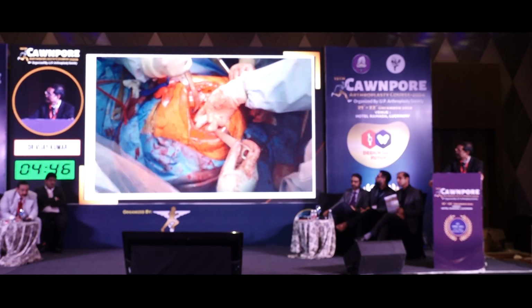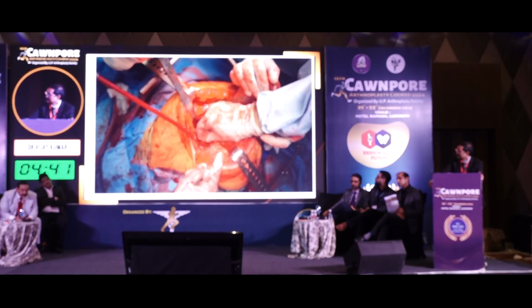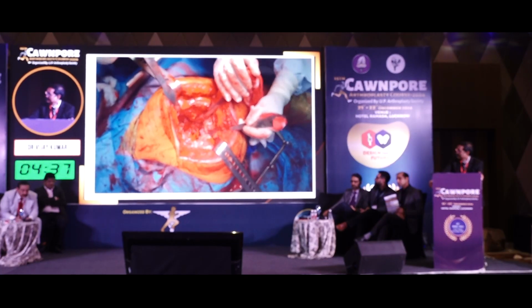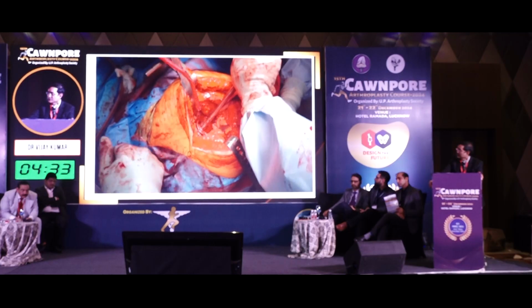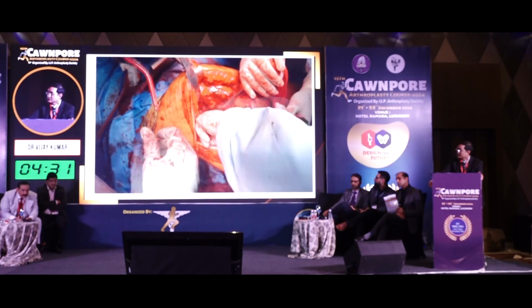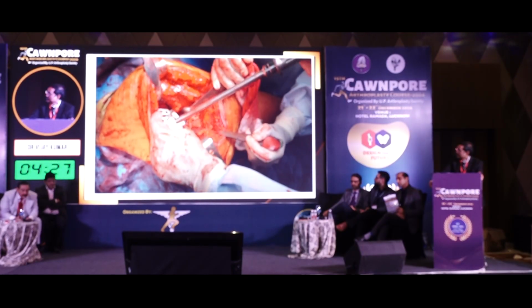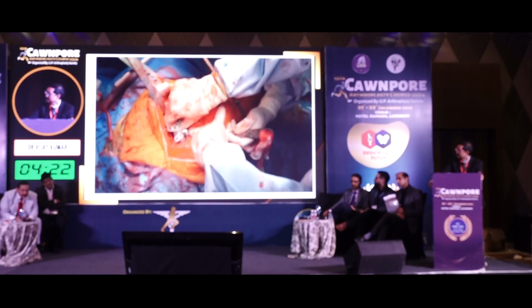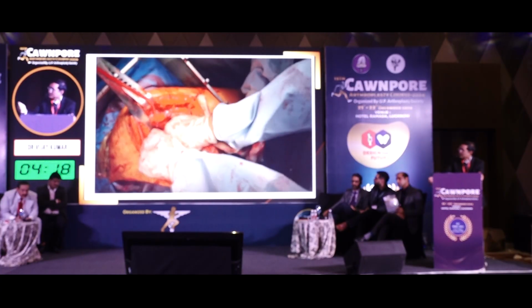In this case, the patient had a big protrusio also, so we used a cage. So this is a trialing for the cage which is being done. You put in a morselized graft there, and then you put in this cage. This is a cementless cage. It comes from the company called Link. It's called a Combi R cage, and it's got a hook which goes into the obturator foramen and has flanges which are fixed on the ilium with screws. So putting the cage, you first put it in the obturator foramen.